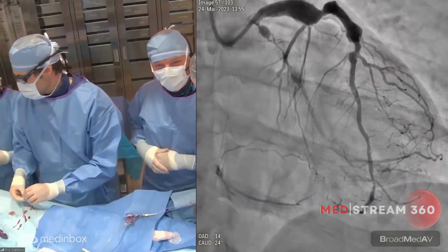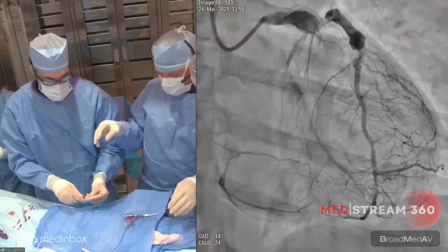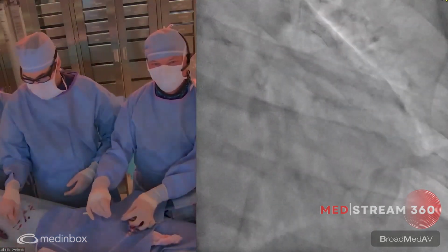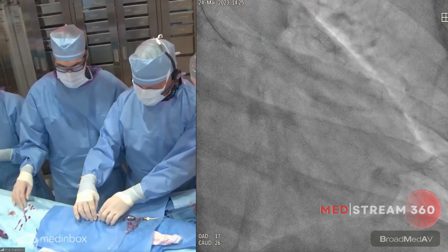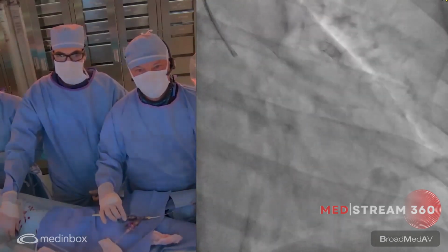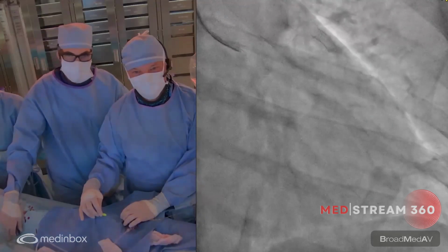And now you can see the aneurysm. So IVUS, in this case, prevented us from post-dilating in the LAD. Focus now on the circumflex marginal. The aneurysm size is somewhere between 2.5 and 7.5. Obviously the cause of Kawasaki is not known. We treat acutely in young patients with immunoglobulin to try to reduce the inflammatory or autoimmune reaction. But the incidence is low: in North America it is 25 per 100,000. Obviously in Japan it is about 10 times more, 250 per 100,000 population.